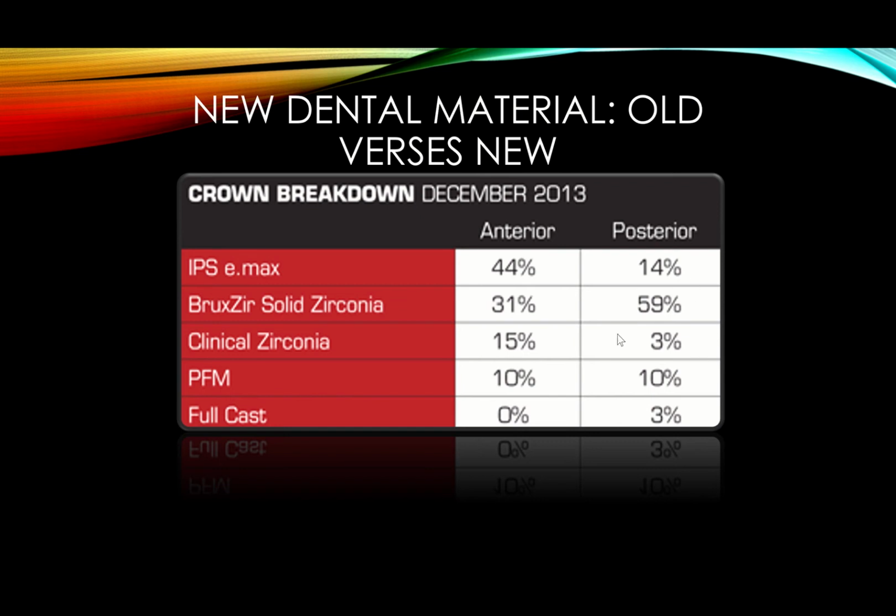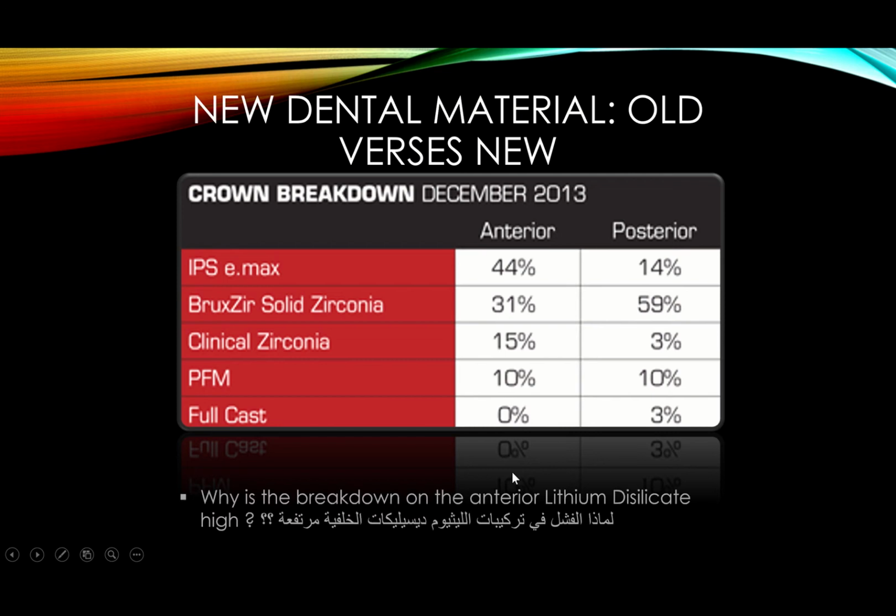So we get less breakages, even though we have more occlusal forces in this posterior region than we have on the anterior, especially if you're talking about veneers or even crowns. It's only lateral protrusive movements. It's not like mastication forces in the back. So in other words, this and other studies influenced me to think about it.